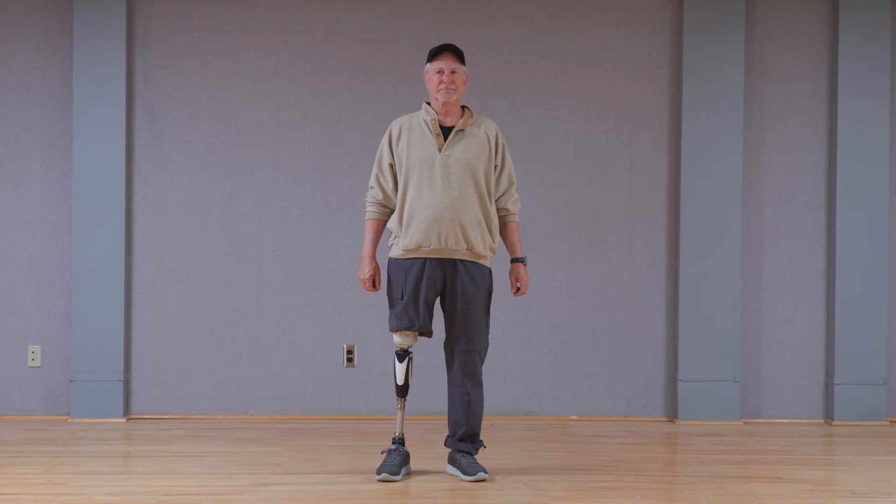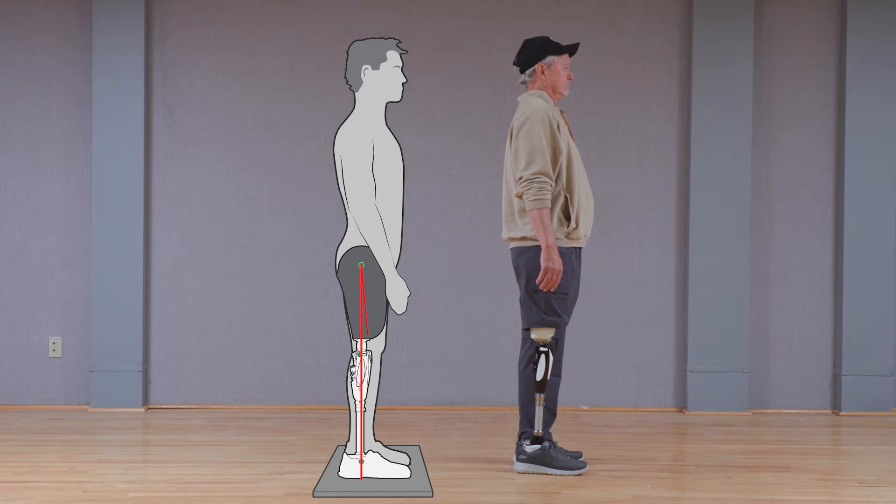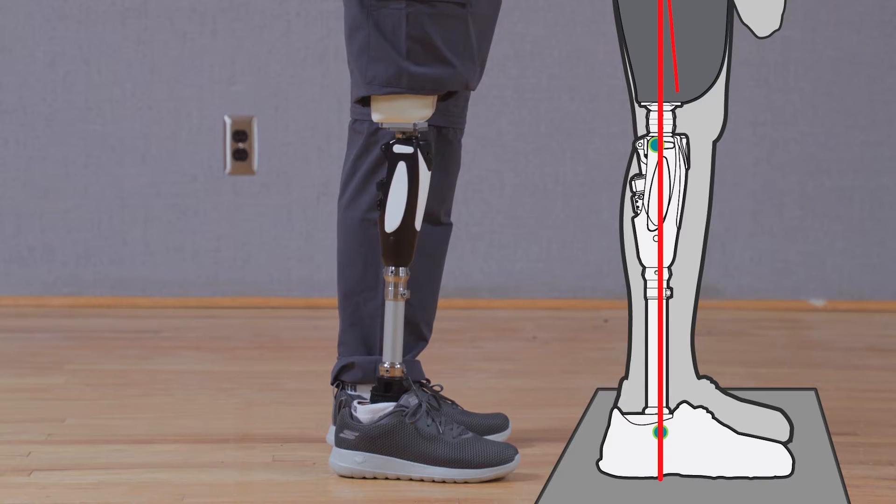The following is the recommended static alignment once the patient dons the prosthesis. This will look different from bench alignment in most cases. The weight line, assumed to be the midpoint of the lateral socket, should now be anterior to the knee axis by 5–35 mm and anterior to the distal pylon attachment and posterior third of the foot.